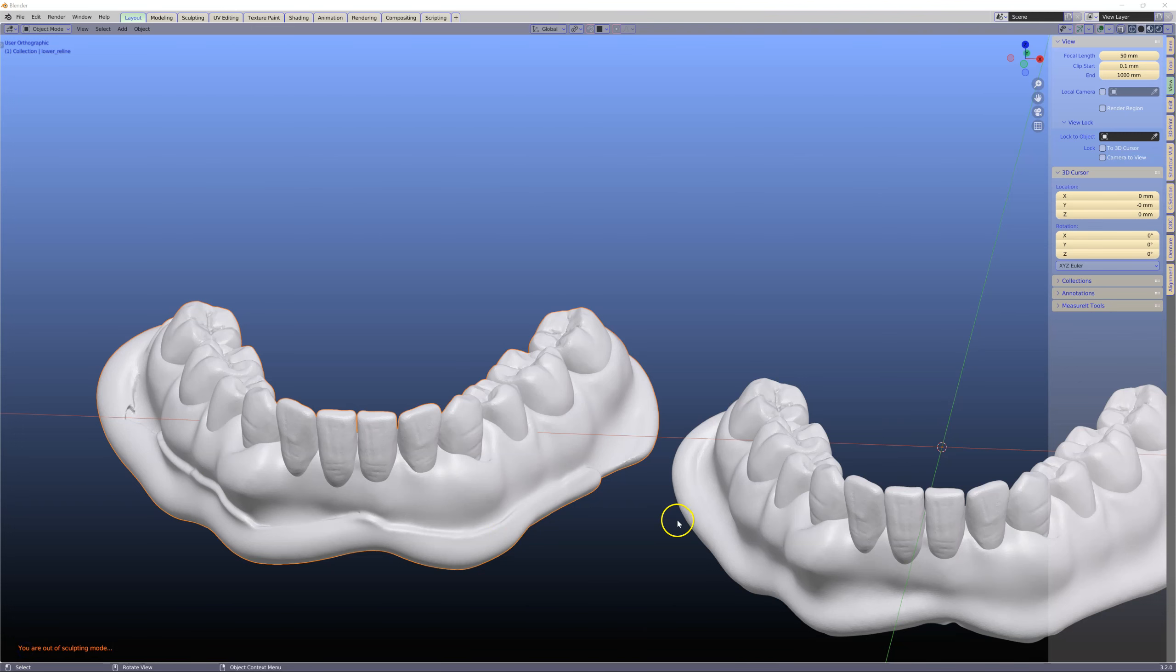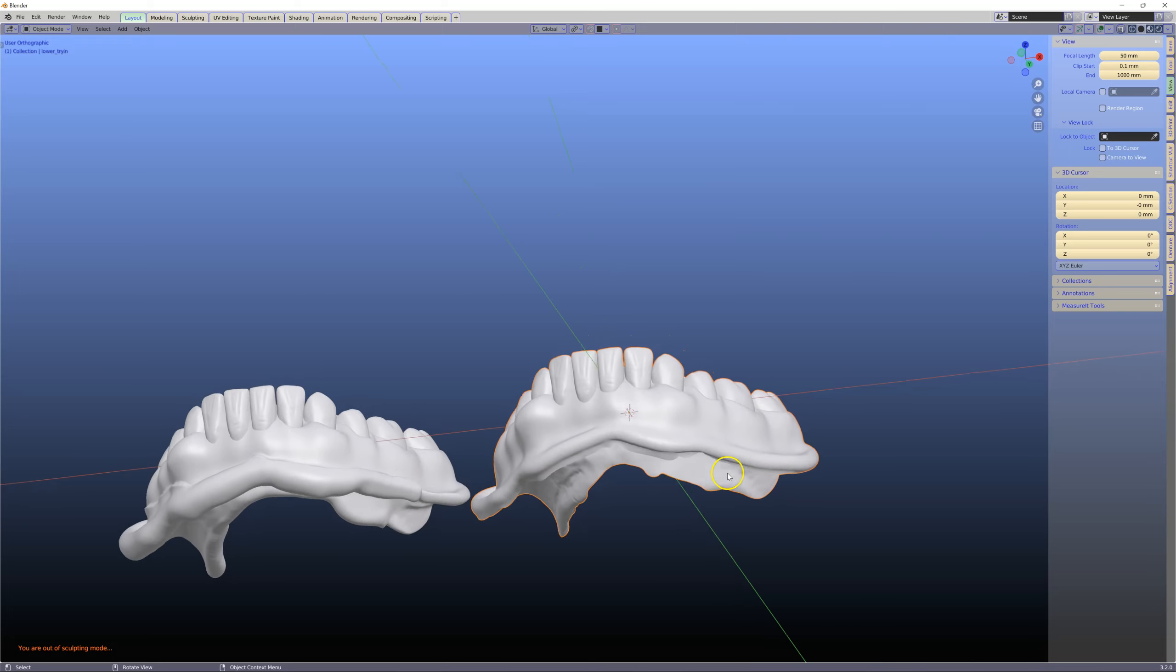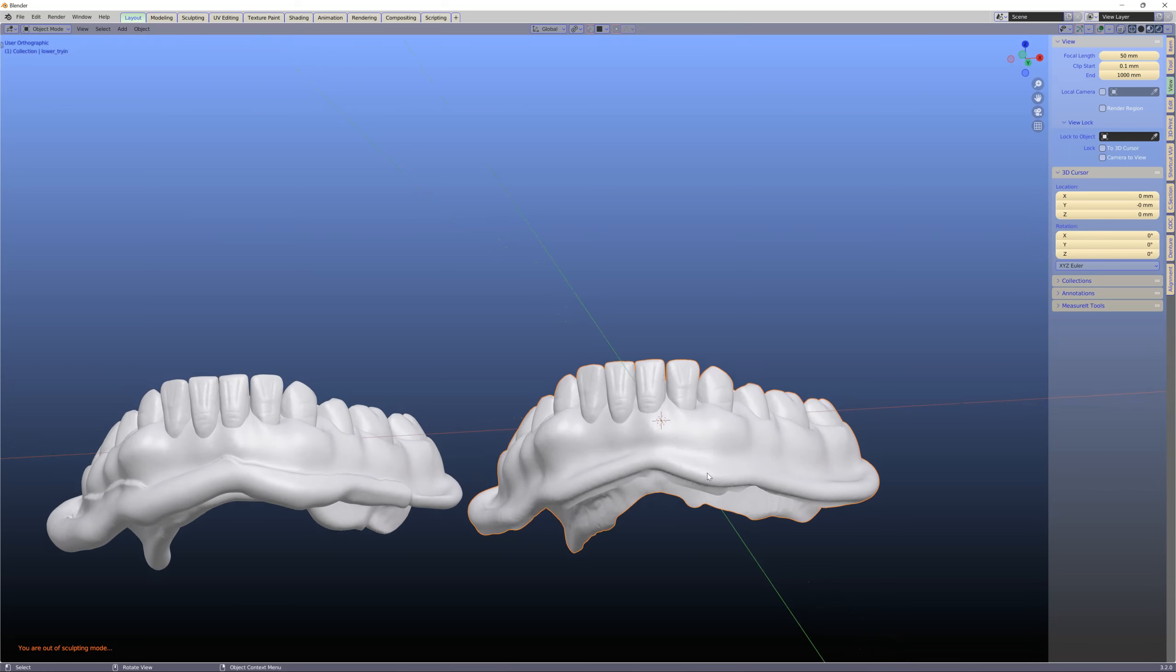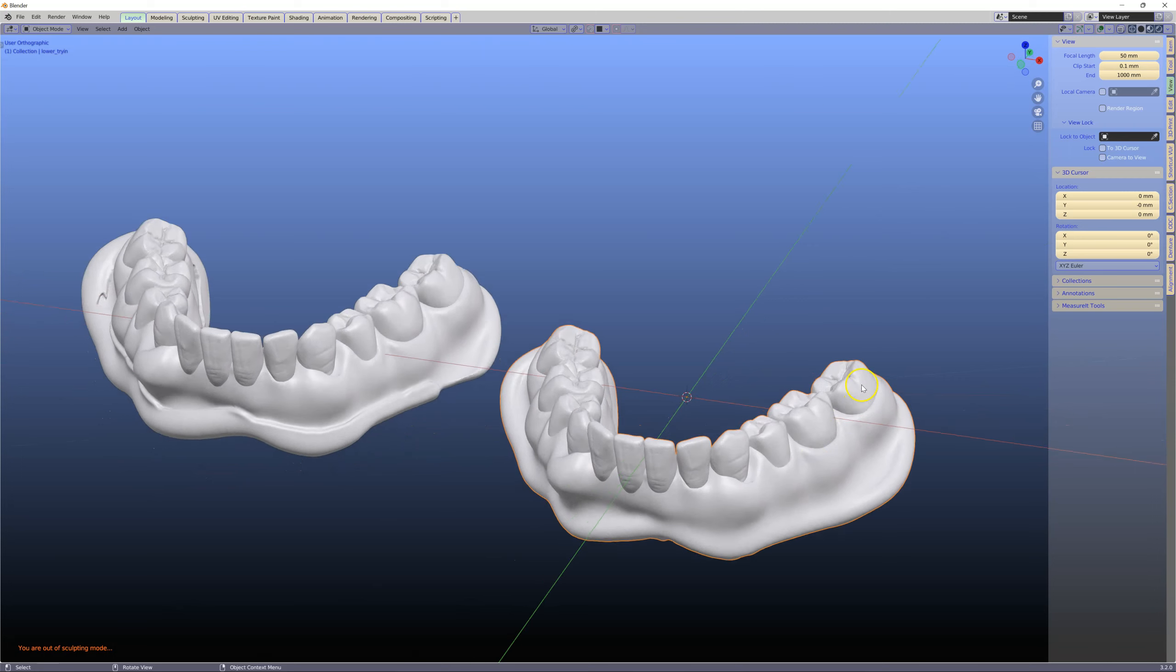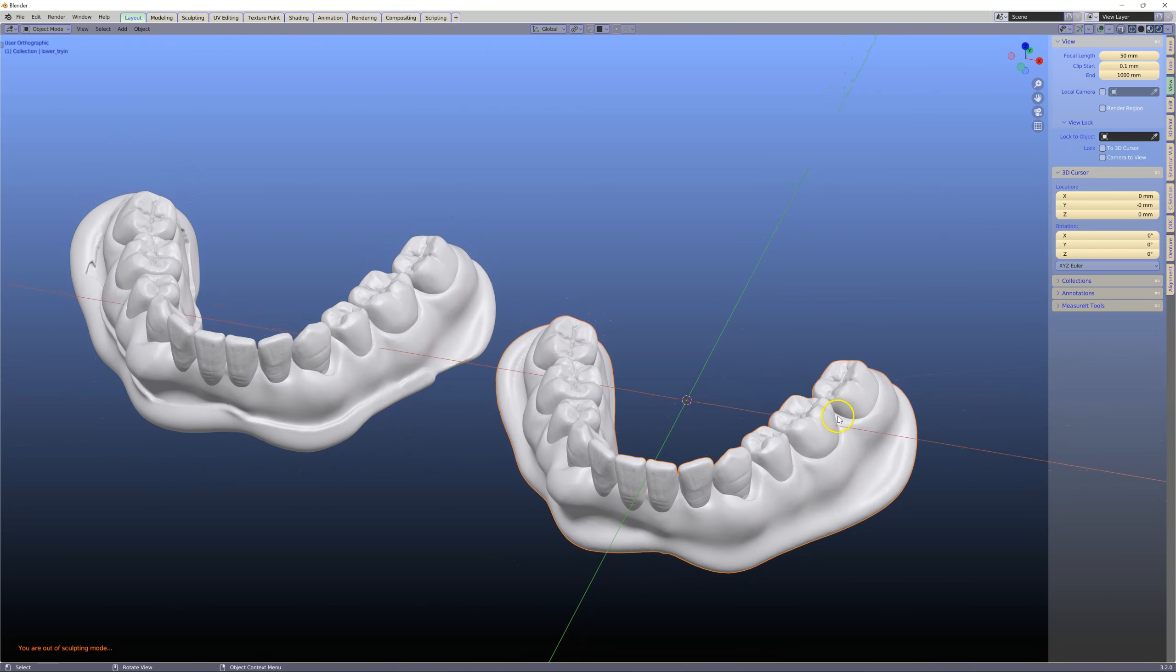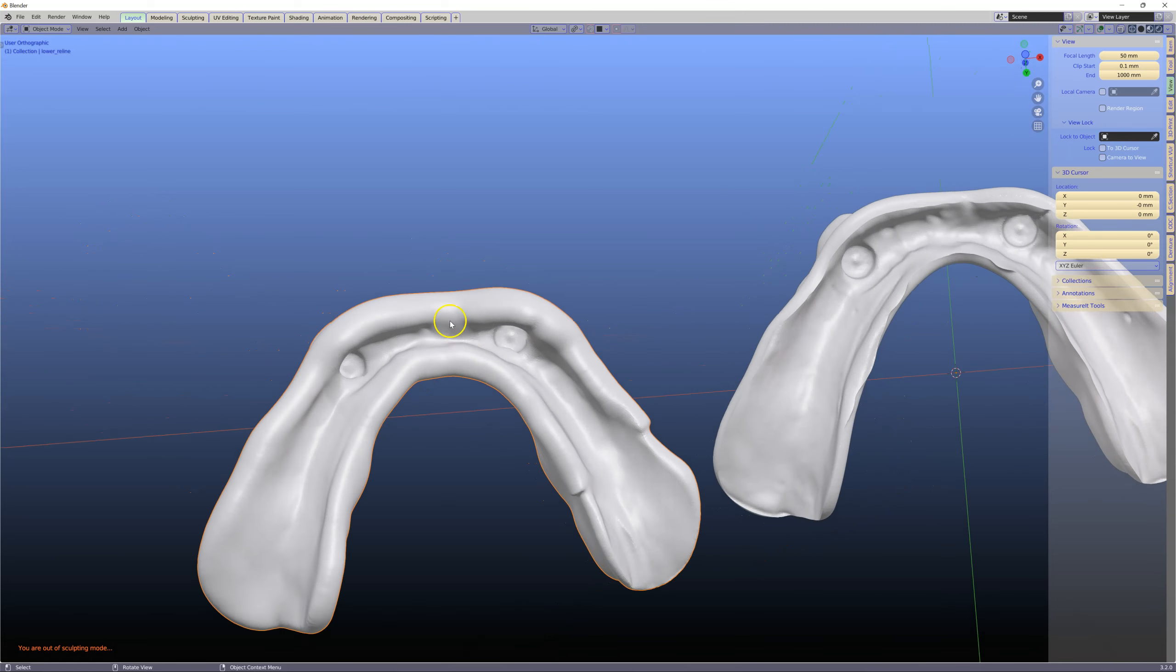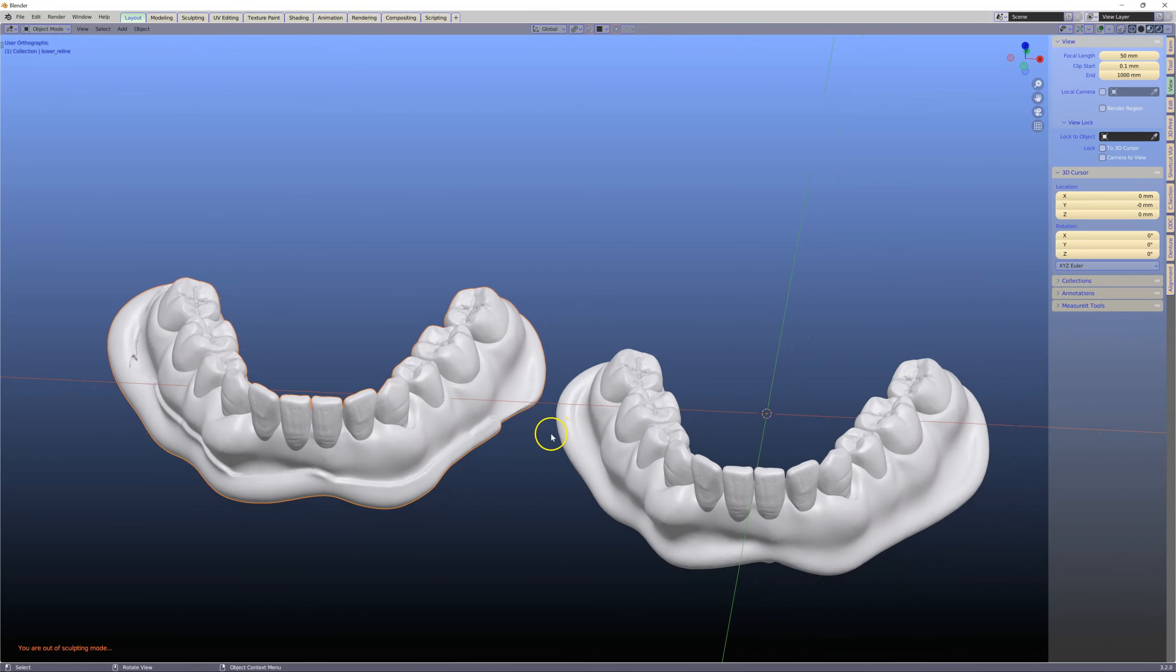Frequently we're in a situation where we send out a denture and it needs to be relined in the mouth because of an ill fit. Assuming this happens, the file has been sent to the dentist, printed, and now the clinician has taken another impression on the inside of the denture. What do we do now?